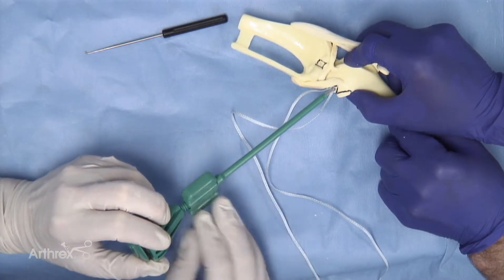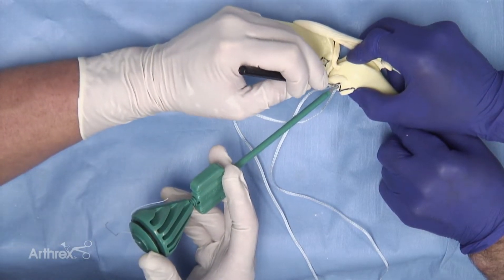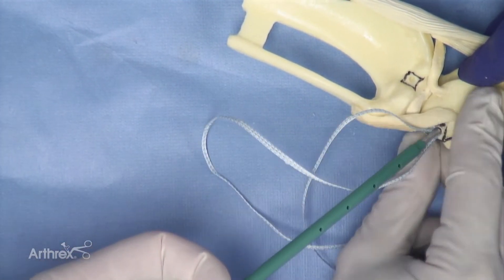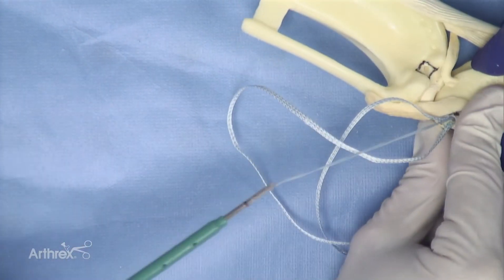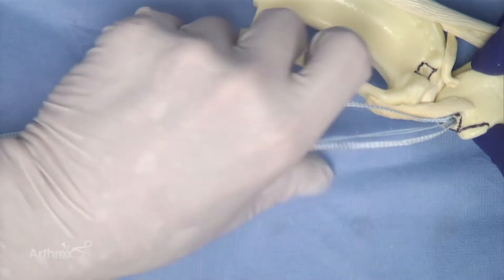At this stage, the insertion can be assessed by unscrewing the green outer sheath to expose the position of the swivel lock implant in the femoral socket. This appears appropriate in this model. The swivel lock applicator is then disengaged.